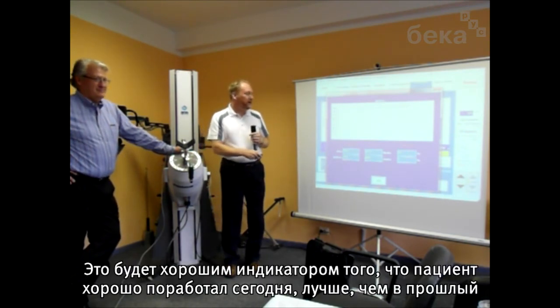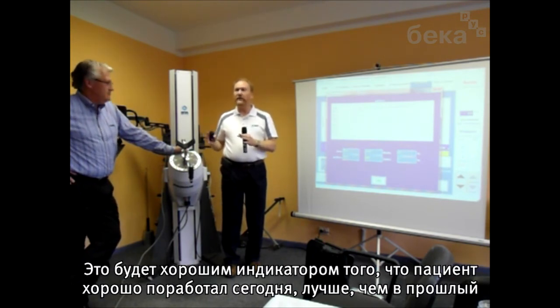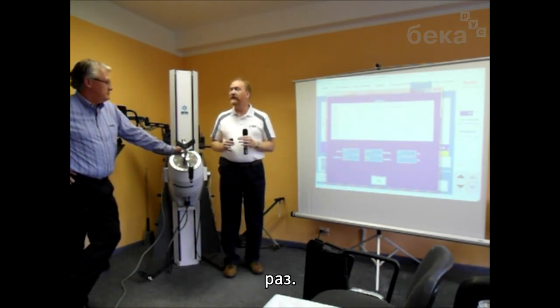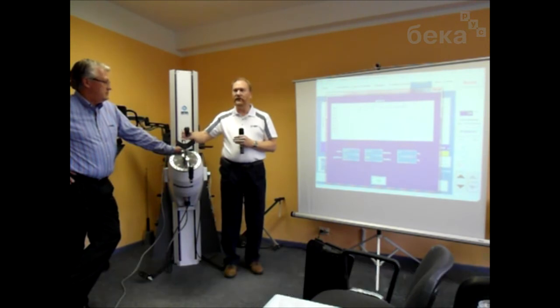So that would be a good indicator now that he did very, very good today, quite a bit better than the last time he did this exercise. So for the next time he comes in, I want to re-challenge him now with a new work level to make him do a little bit more.